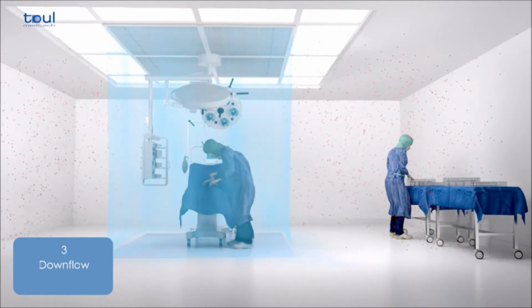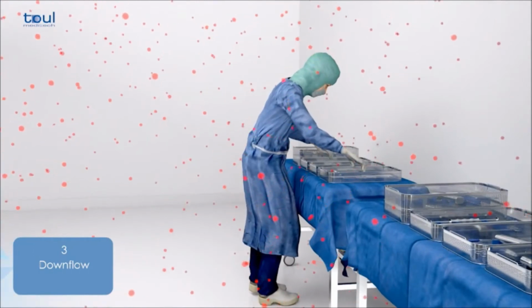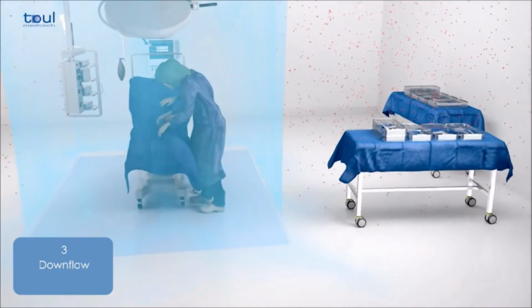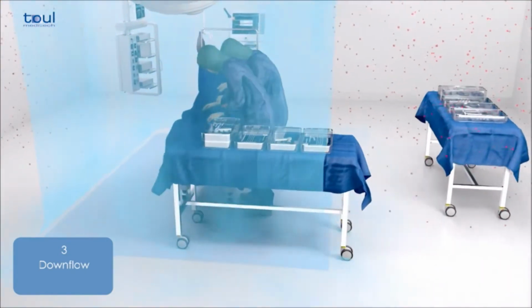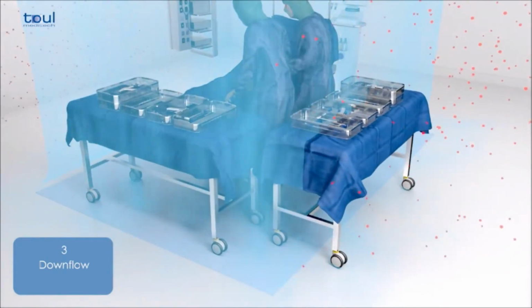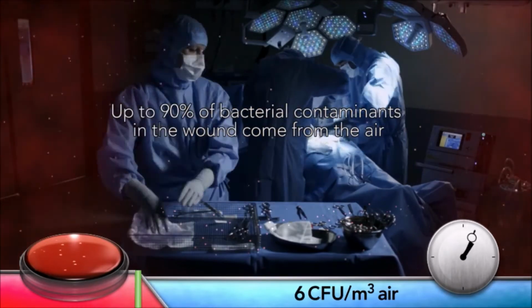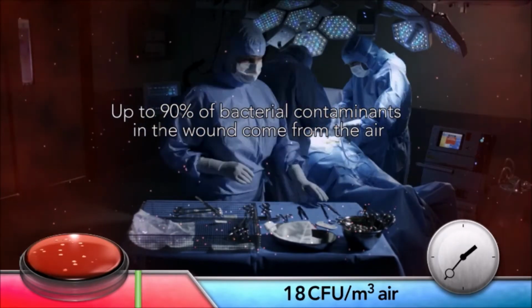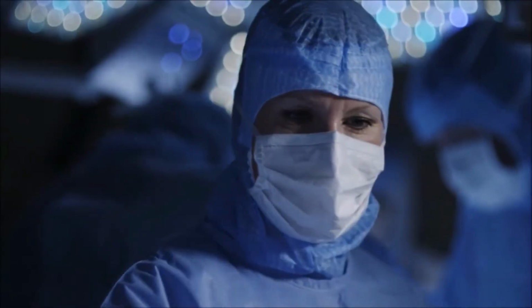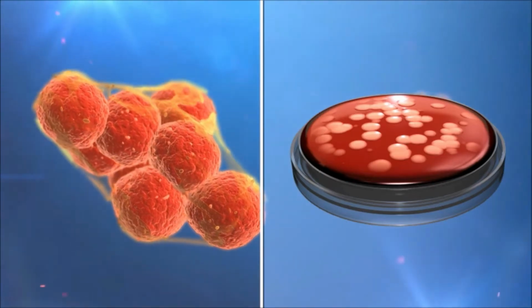Even in more modern operating theatres with a large ceiling-mounted laminar flow system, the instruments are almost always prepared outside the sterile zone and have thus lost their sterility before they are used. After 1 hour of surgery, the bacterial loads on the instruments are already very high. For elderly or immunosuppressed patients or in the presence of prostheses, even a very low bacterial load is enough to cause infection or rejection of the prosthesis.